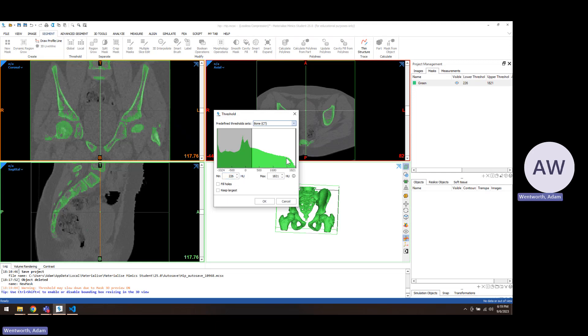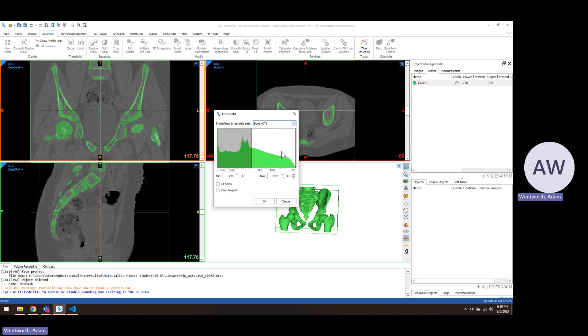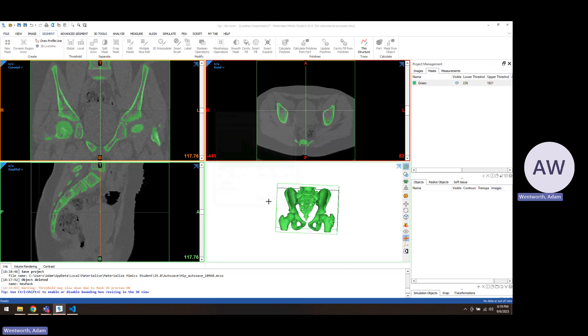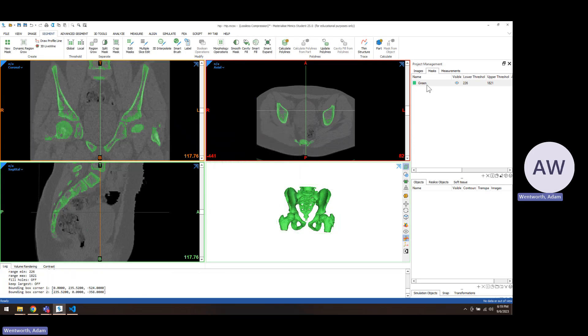The default value for bones starts at 226 and just kind of goes to the maximum. If you have metal somewhere in your hip, these would likely start around 1600 and then go to the max. And so if you want to separate bone and metal, that's kind of a different thing. You would do a different threshold to get metal and then to get bone, you just go up to where the metal starts so they don't overlap. We'll start there and we don't need to rename this right now because we'll actually delete that later.